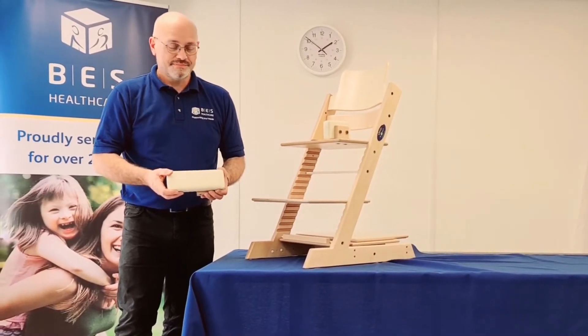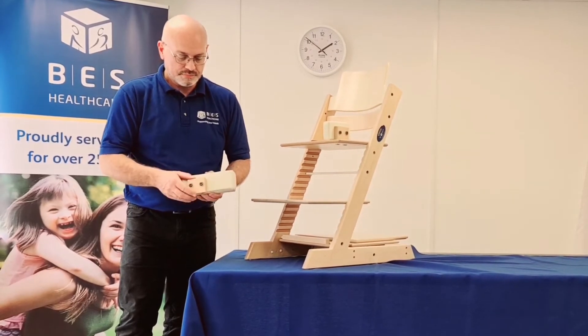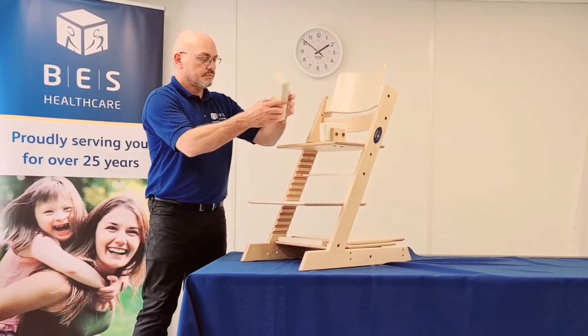The long 8 inch thigh pads are handed left and right. These offer more support and can also be reversed for more control of the knees.